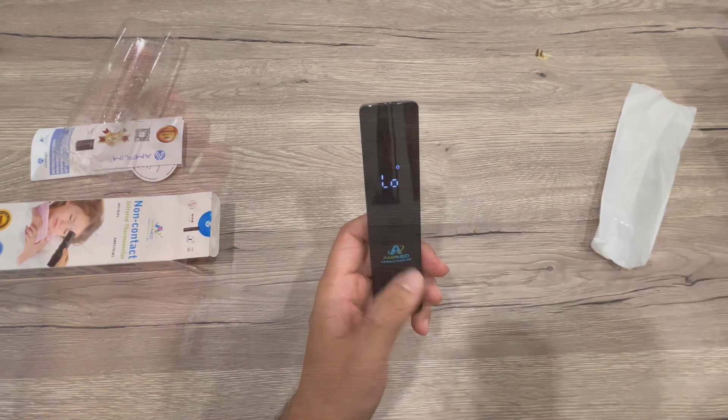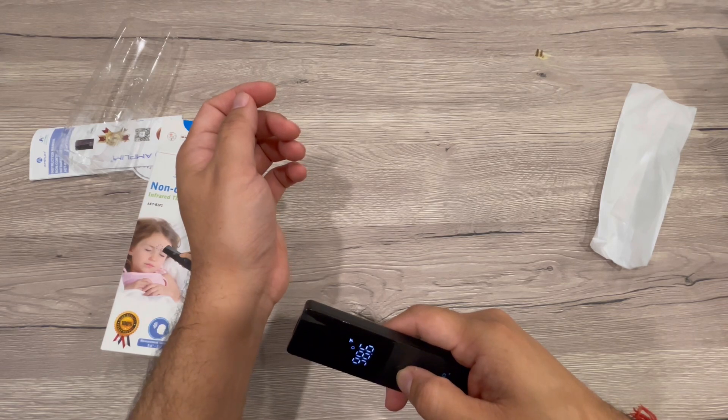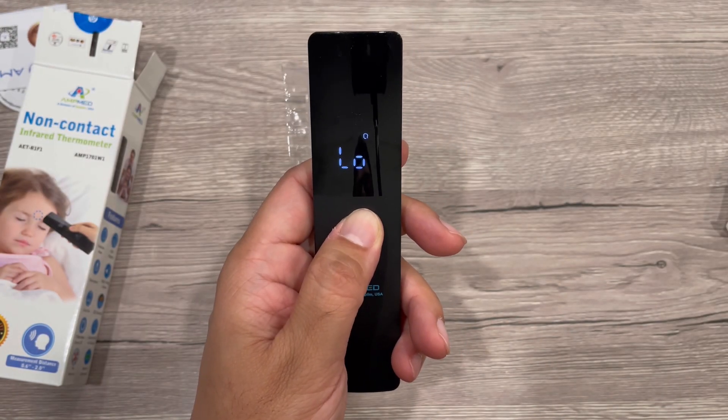This is the on and off button, as you can see. You keep it a little bit away from the surface you want to measure, and it will read. You put it on your forehead and it reads the temperature — very nice, handy, and looks really good.